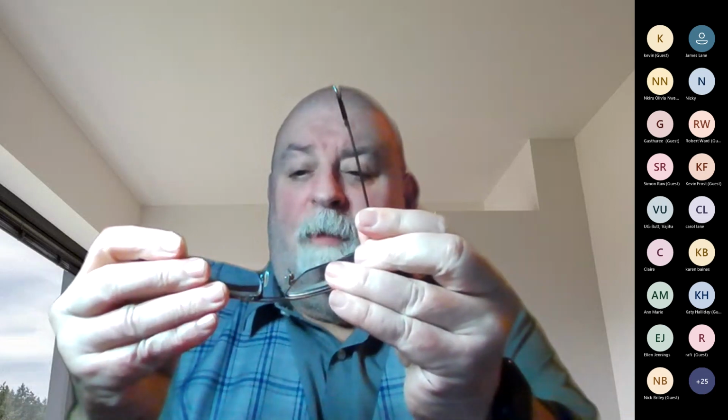And as I tilt it that way, I'm twisting it around the vertical. So that is going to give me a vertical induced cylinder. So if I've got that one and that one both wrong, then we are going to adversely affect the prescription by more than we normally would by just having one of them wrong.